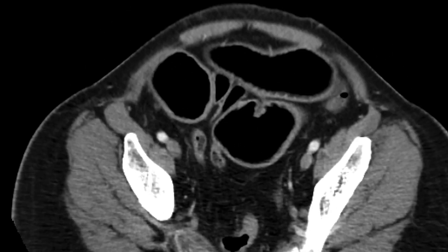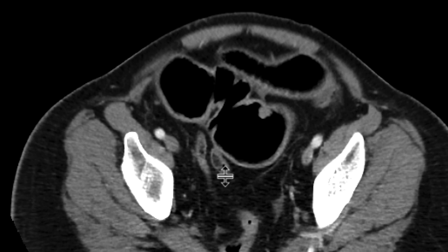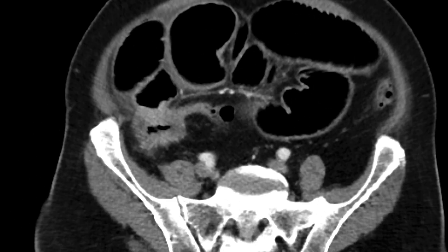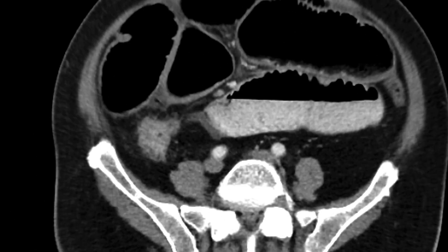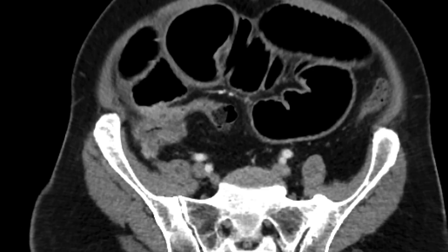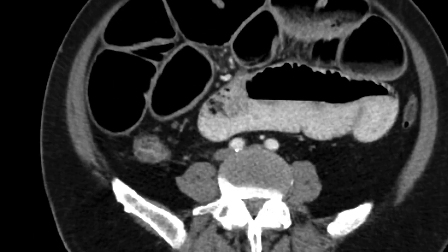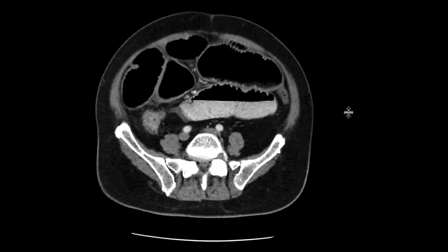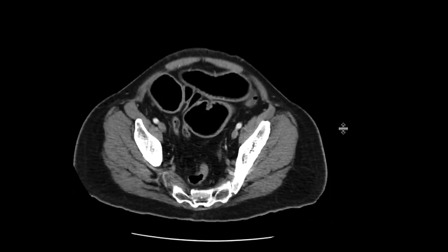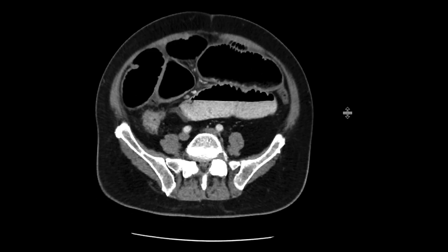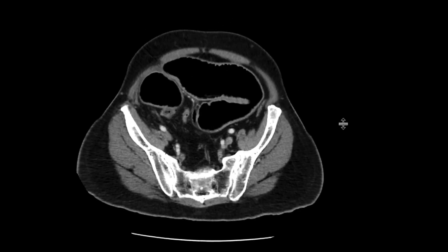We can also see there's a portion of the sigmoid colon down here looping all the way upwards to that right lower quadrant and is involved with that neoplasm. And so this is really an aggressive cecum and approximately ascending colon neoplasm, resulting in a small bowel obstruction and extending out laterally to involve a portion of the sigmoid colon as well.